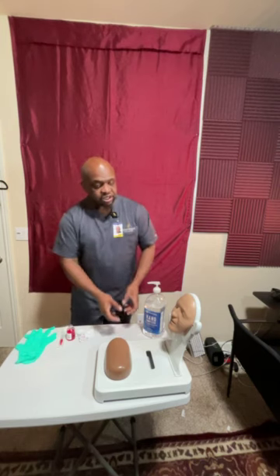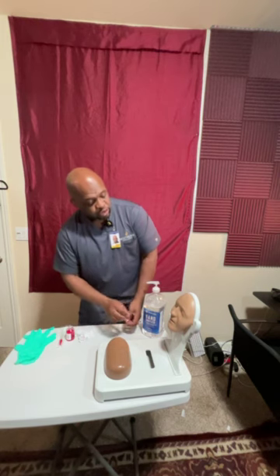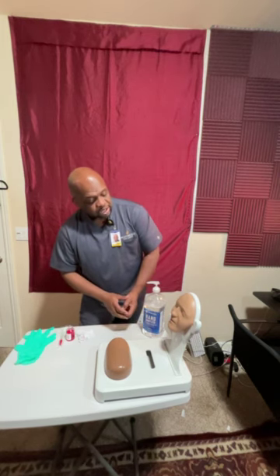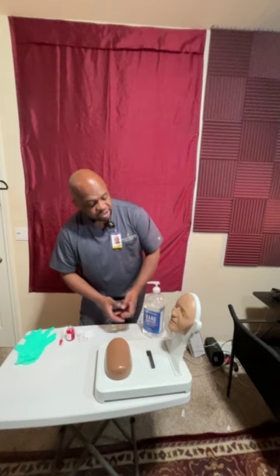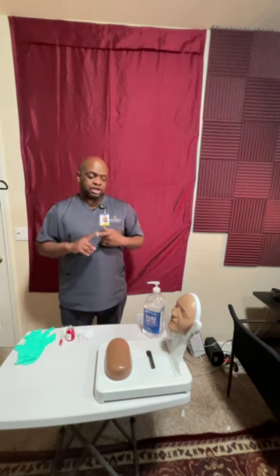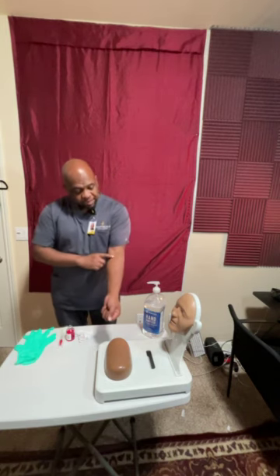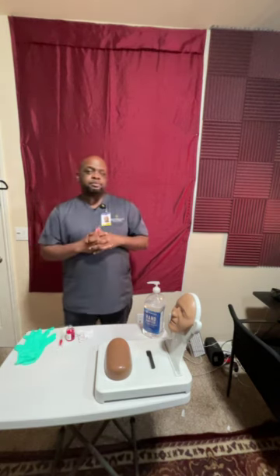So, Mr. Jones, can I please see your wristband? Mr. Jones is going to give me his wristband. Mr. Jones, can you please tell me your name and your birthday? Right? So he'll say, Tim Jones, 1955 is your birthday. Thank you very much. That looks good. As I said, Mr. Jones, I'm going to be administering 0.1 mLs of tuberculin medication for the skin test. It's going to go right up under your skin there, leaving a little bubble.